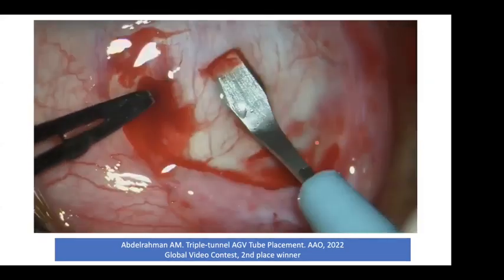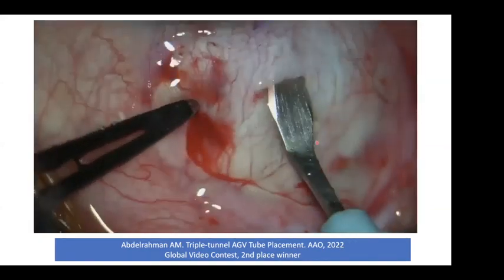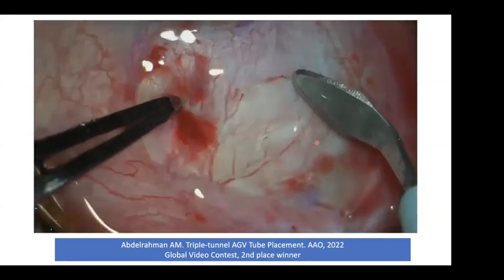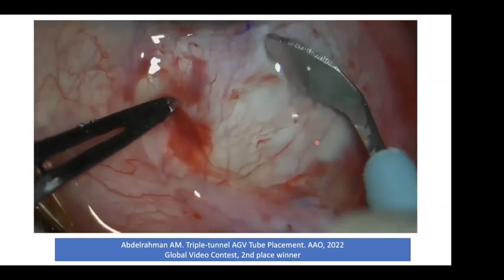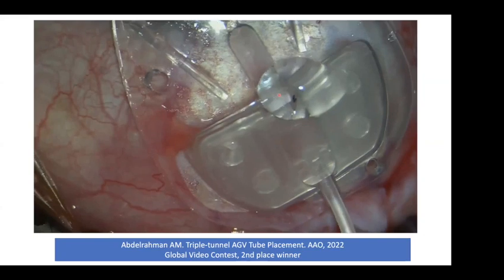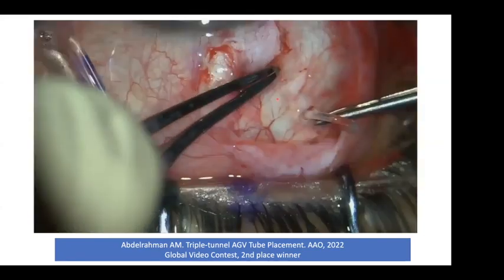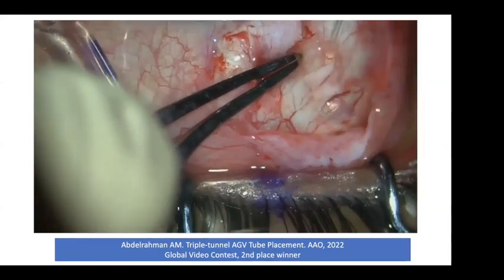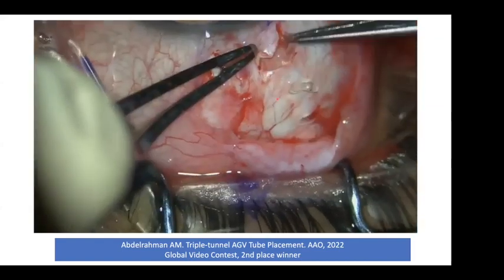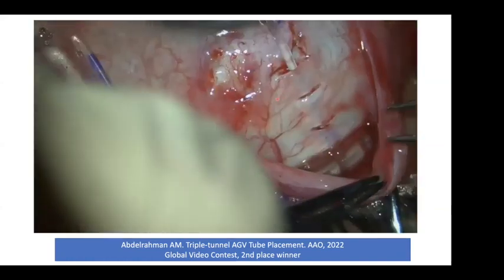So again, this is the last part. Again, it's a flap. I know that you can do a tunnel, but with the tunnel in my hands, it was not easy to implant the tube through the tunnel, so I decided to make it like a trap door, so that you can cut one edge, or you can make it like a flap. So again, you can just gently push the tube. It will come because the tube is beveled, and then you will immediately move it. And sometimes you can take it without getting it out of every tunnel, a single pass.